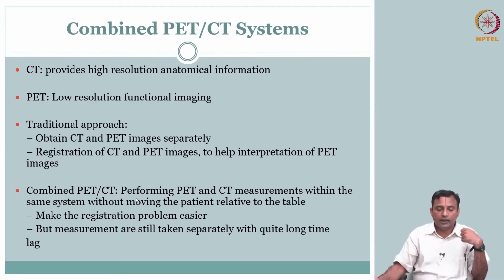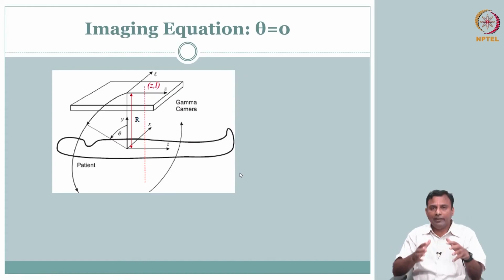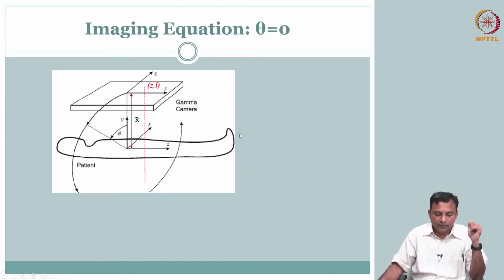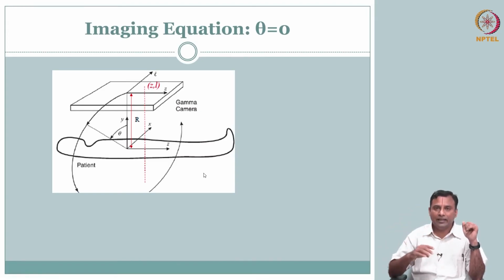Okay. So with respect to instrumentation, this is what it is. Now let us get to our imaging. Given this instrumentation, you have detected. So where is the patient? Here is the patient. What do we want to see? Oh, we want to see tomography. So axial slices is what traditionally we are looking at. That means I have to first get my coordinate system correct.